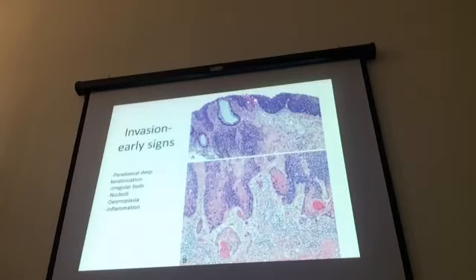So usually the keratinization happens on the top, but if we see it happening on the bottom, then we become suspicious for invasion. When we see irregular buds like these, that also suggests invasion. When cells begin to acquire nucleoli, especially along this margin, that usually means that the invasion is incipient. And then the stroma with inflammation and desmoplasia. You know these very well from your training.